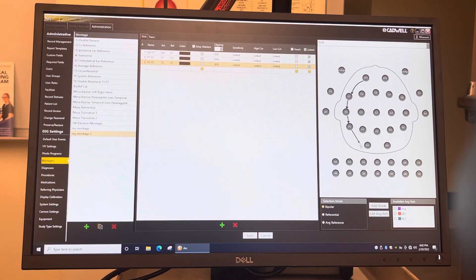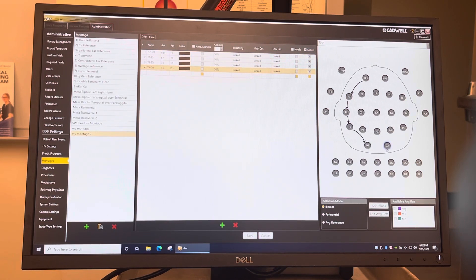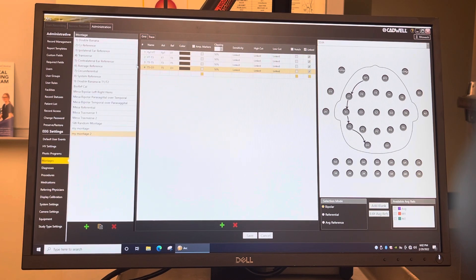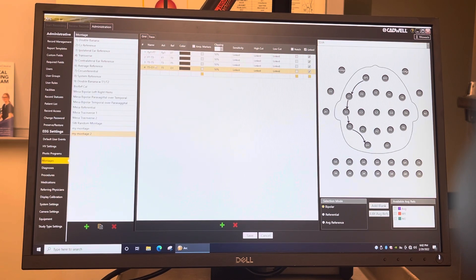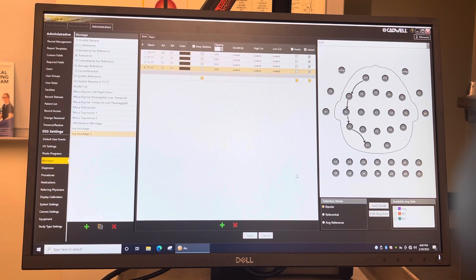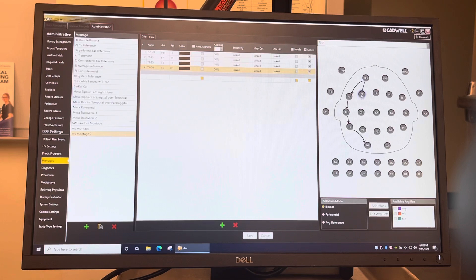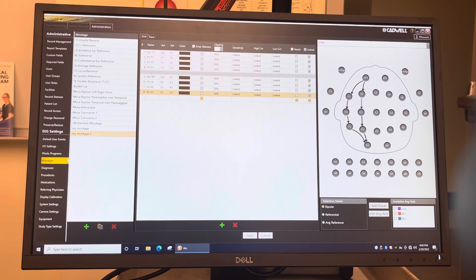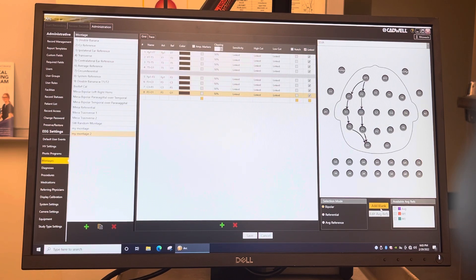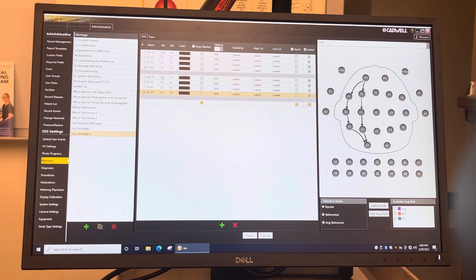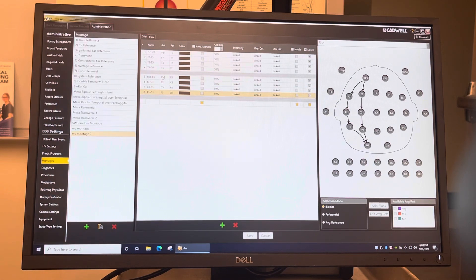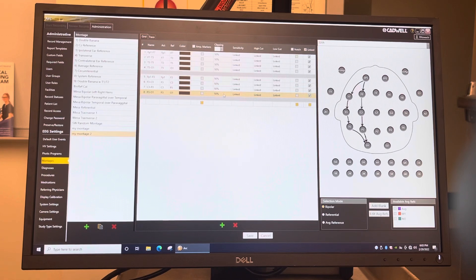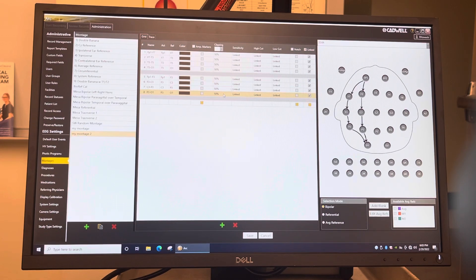So I'm going to do a left over right hemisphere. So after you get done with the first chain going around here, you add a blank. Now you can go for the second chain. And then you add another blank. It's always nice to have blanks in between your chains so when it's displayed on the screen when you're recording, it's not all munched or kind of scrunched together.